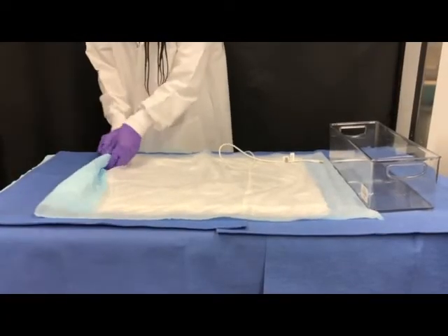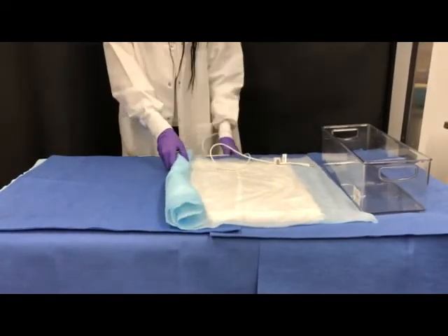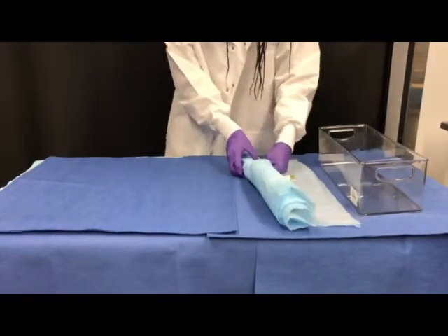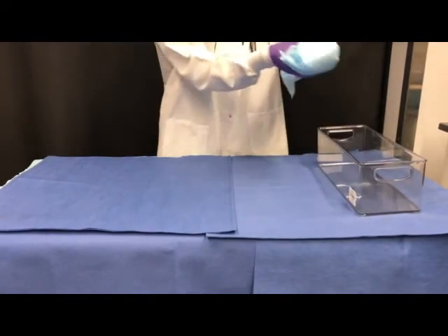After drying, wrap the pocket colposcope in cloth, ensuring that the cord does not come into contact with the probe itself. Then place the pocket colposcope in a sterile container where it will remain until its next clinical use.